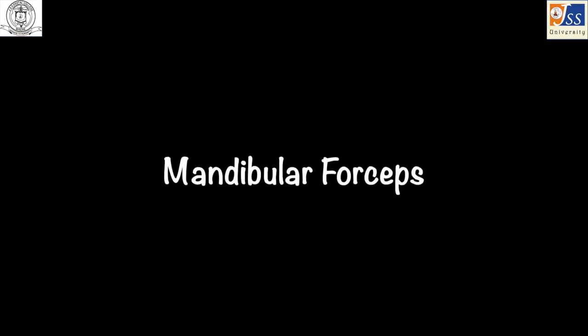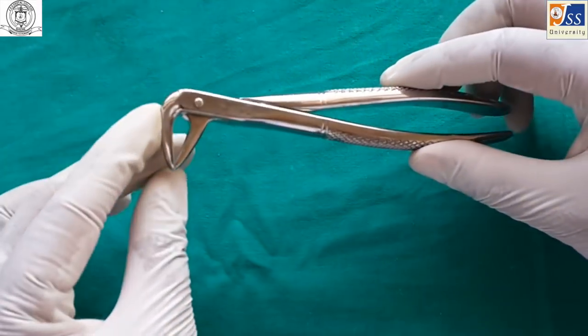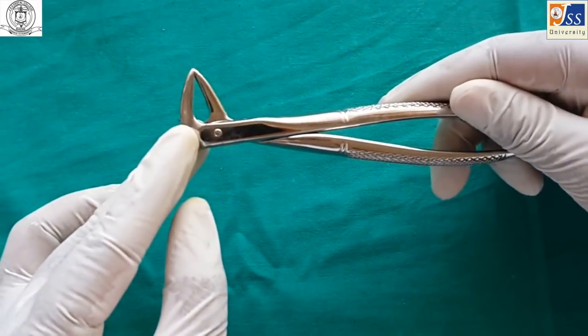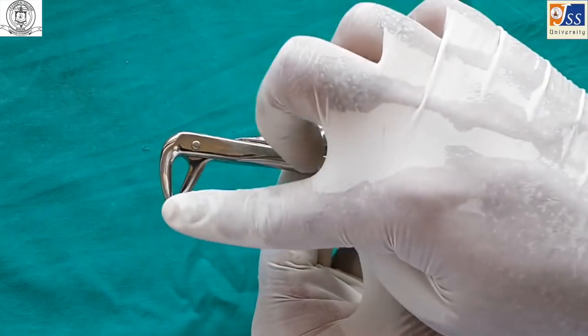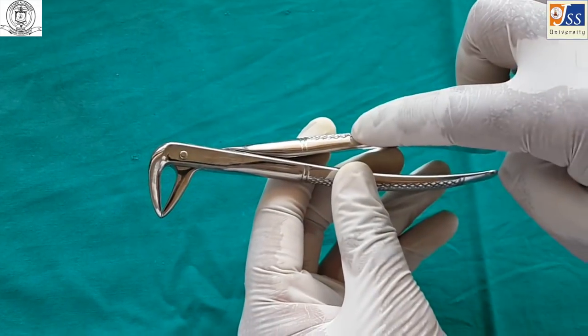The mandibular anterior forceps is used for the extraction of mandibular anterior teeth and sometimes for root stumps. In this forceps, the beaks are smooth and come in contact with each other.